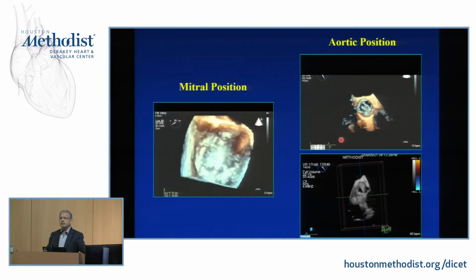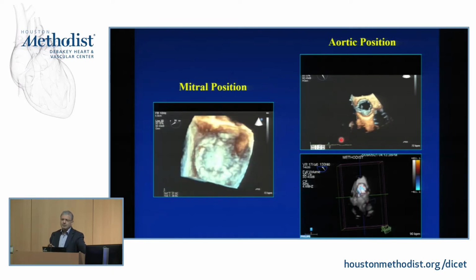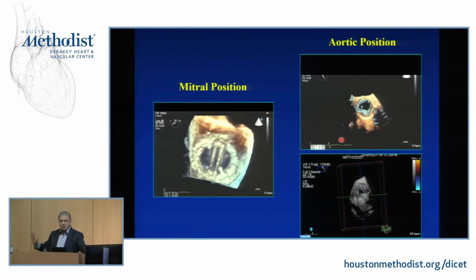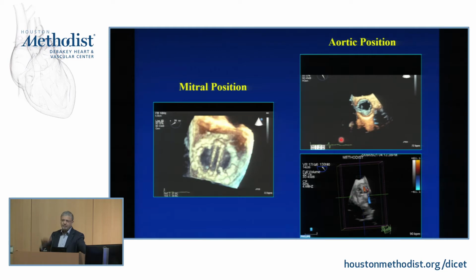On the right side is aortic position. And I think we have to admit in this room that for you to tell a clinician, an investigator, an interventionalist, a surgeon, that a valve motion is normal, I would tell you that no more than 20% of the time will I feel comfortable that indeed this valve motion is completely normal. So let's forget about egos and everything else. With echocardiography, you're not going to be able to do that. And the reason you're not is you're imaging on the side as opposed to en face.